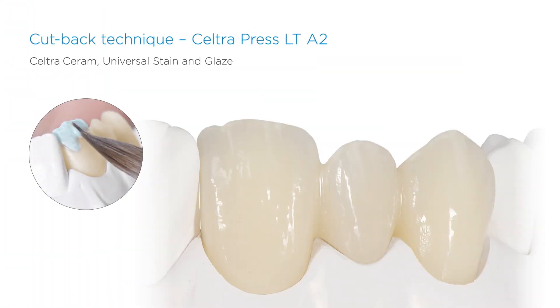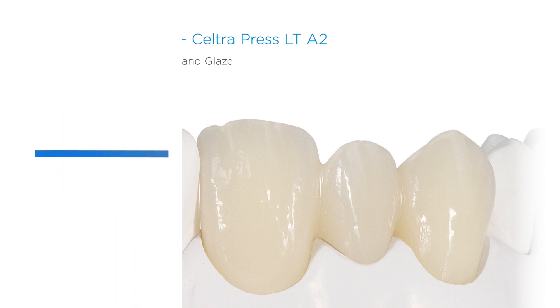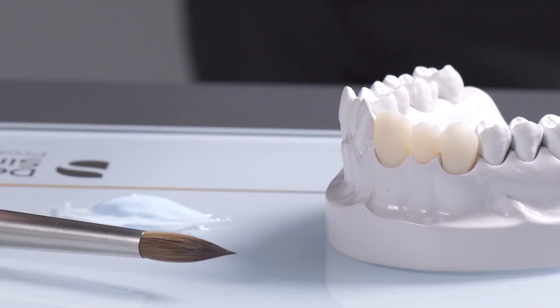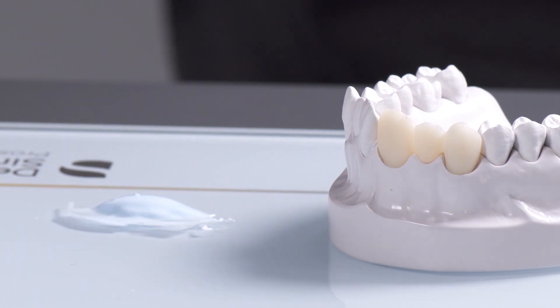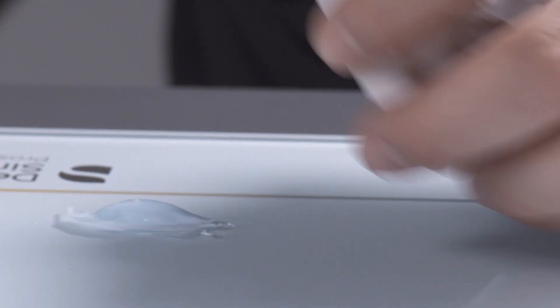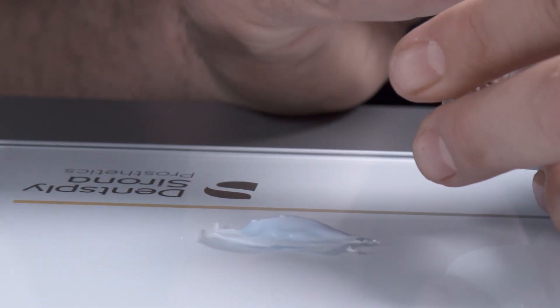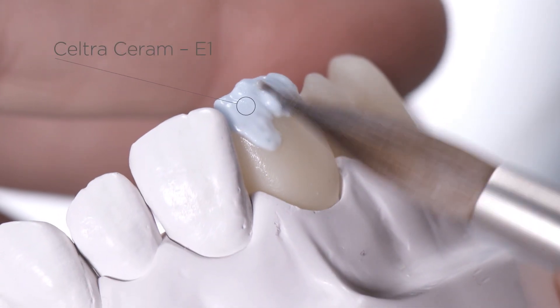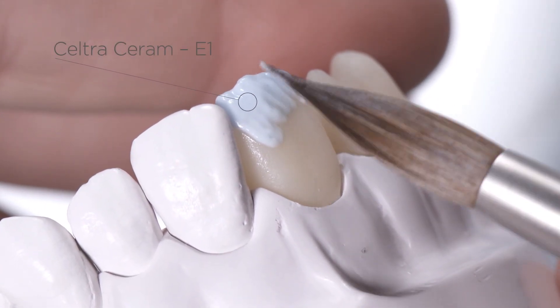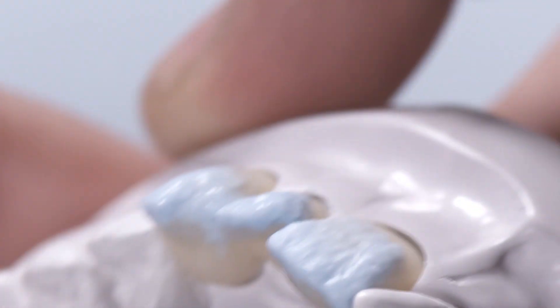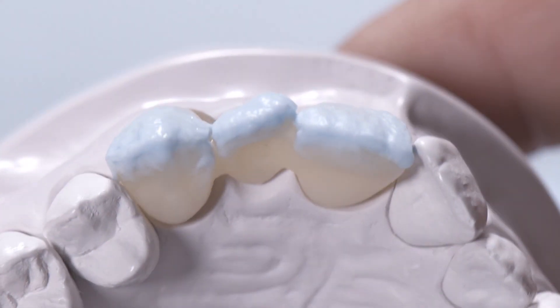Seltra Press already provides a high level of aesthetics in monolithic mode. Using the cutback technique with just a single incisal material, this aesthetic result can be further enhanced. For this, we use Seltra Ceram Enamel E1. The Mamelon structures were created when designing the framework. Build up the labial and palatal aspects of the enamel layer with Enamel E1 and shape them to obtain their final contours.